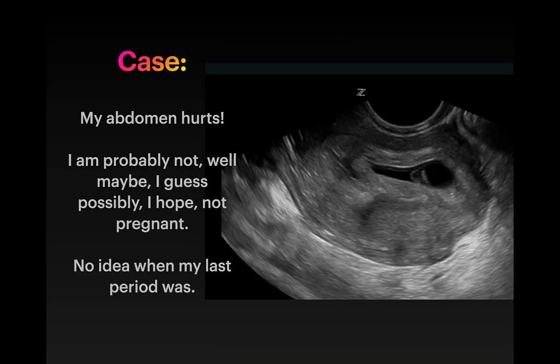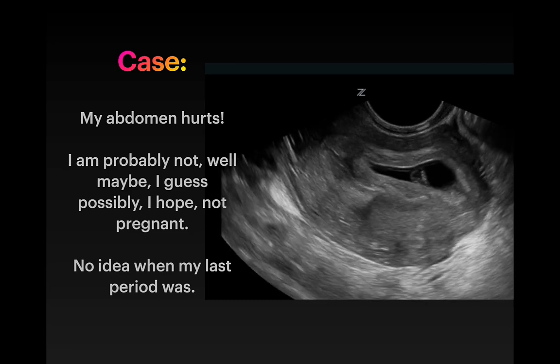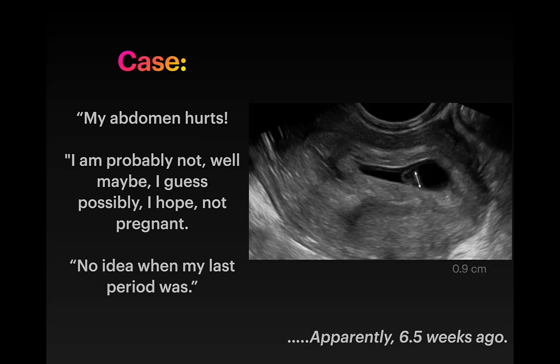All right, so two quick cases here. First one, my stomach hurts. I don't think I guess I could be. But yeah, no, I don't know when my period was. Why would I know? So you're going to help her out. Her period was approximately 6.5 weeks ago.